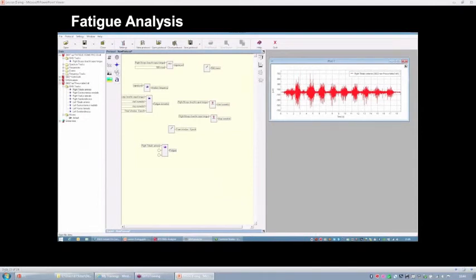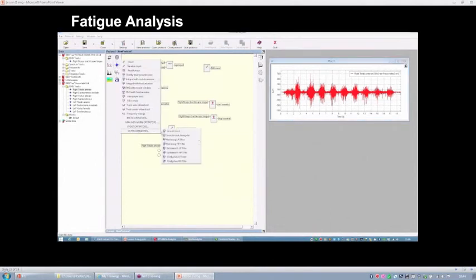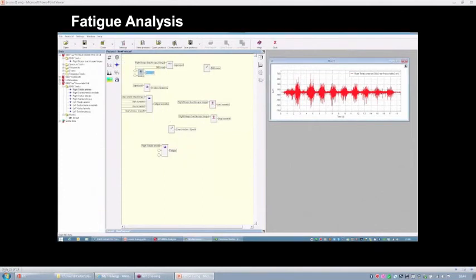So for example, I'm going to use the peak of the EMG envelope. So we are going to compute the envelope of the signal by means of a low pass filter. I now set up the cutoff frequency. I'm going to choose 3 Hz. Remember that we have to rectify the signal before filtering. Okay, so this is the envelope.